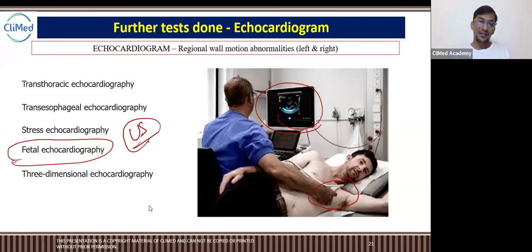What is applied during the procedure? What is that gel? Ankit Sharma, please tell what is the gel. People are asking what the gel is. Yes, that is conductive gel. It helps in getting the sounds better. This is not a lubricant.